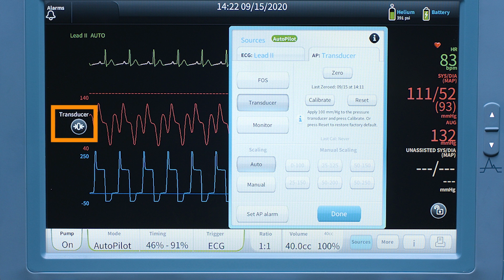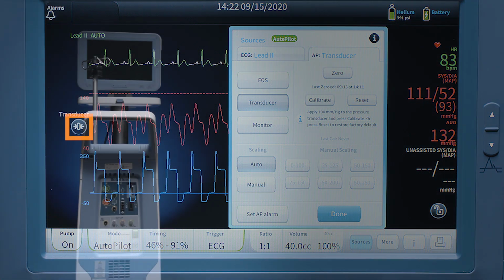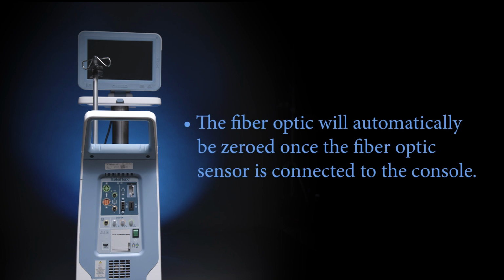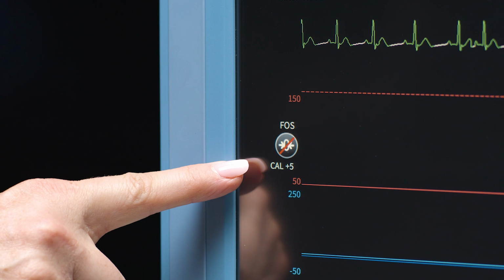The 0 symbol indicates the 0 status and access to zeroing and calibration functions. The current source of the arterial pressure displayed is identified, and it has been zeroed if there is no red line through the symbol. Note, it is recommended that the fiber optic sensor be zeroed prior to the balloon being inserted into the patient. The fiber optic will automatically be zeroed once the fiber optic sensor is connected to the console. If the fiber optic sensor has not been zeroed prior to insertion, but has been calibrated, the 0 symbol will continue to have a red line through it and the calibration factor will be displayed below the 0 symbol. A red line through the 0 symbol indicates the current arterial pressure source has not been zeroed.